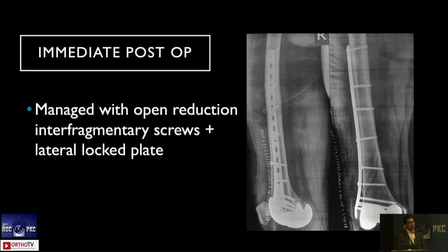As this is a simple fracture pattern and a good bone stock, it was managed with open reduction through a lateral approach, lag screw fixation of the fracture, getting an anatomical reduction, and a lateral locking plate.